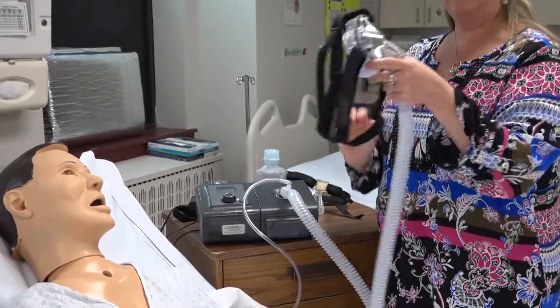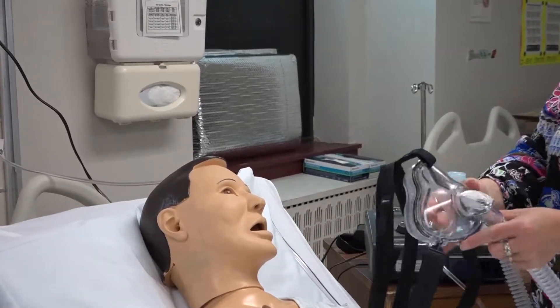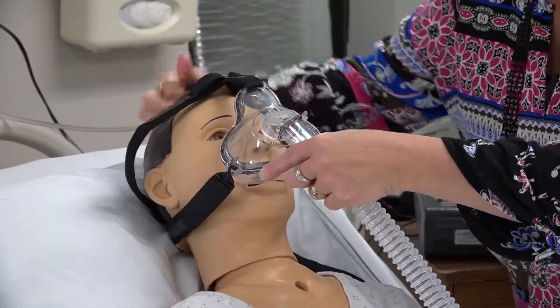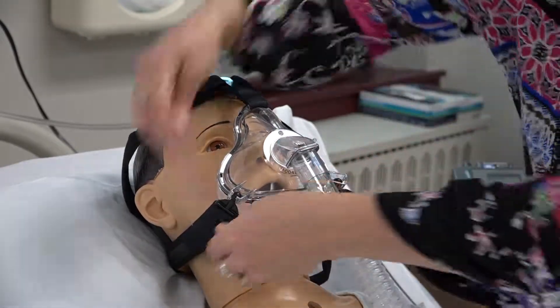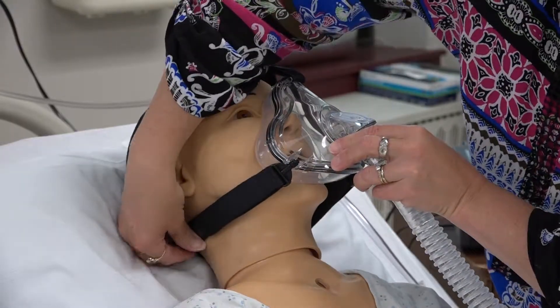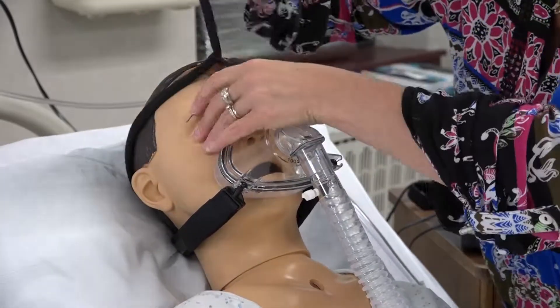Then adjust and fit the mask to your patient. This is a full face mask, going from the bridge of the nose to the bottom of the lip. When you first put it on, if you can get your patient to help, that's great — otherwise you may need a couple of extra hands. Get the mask to fit softly against the face, then use the Velcro straps to adjust. Don't over-tighten it — if it's too tight it will be uncomfortable and the patient won't want to wear the machine. When checking for leaks, a small one that isn't affecting anything is acceptable as long as the patient is tolerating well.